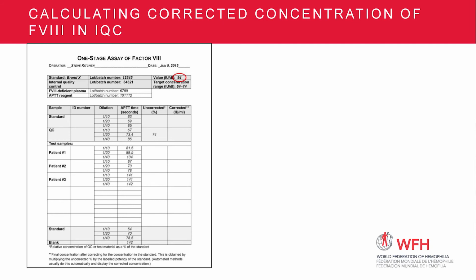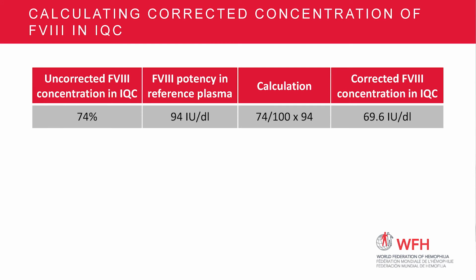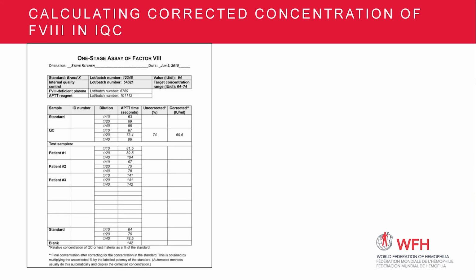So we now need to know what is the potency of factor VIII in the reference plasma we've used to construct this assay and this line. The particular reference plasma that we used had an assigned potency of 94 international units per deciliter. It's a pooled normal plasma. It's close to 100, but not exactly 100. 94 international units per deciliter. The concentration of factor VIII in the IQC material is 74% of 94, 69.6, 70 international units per deciliter.